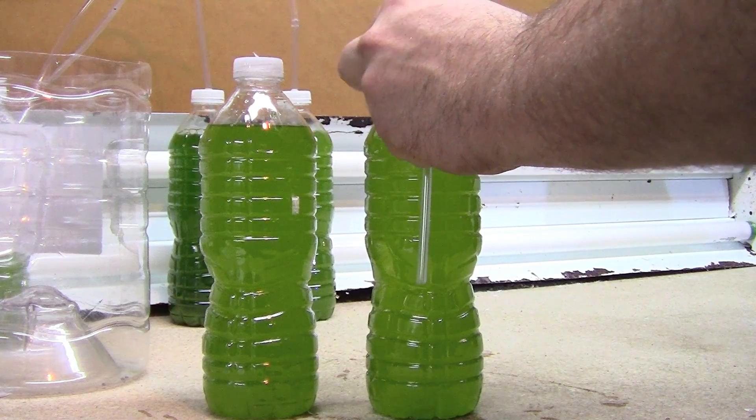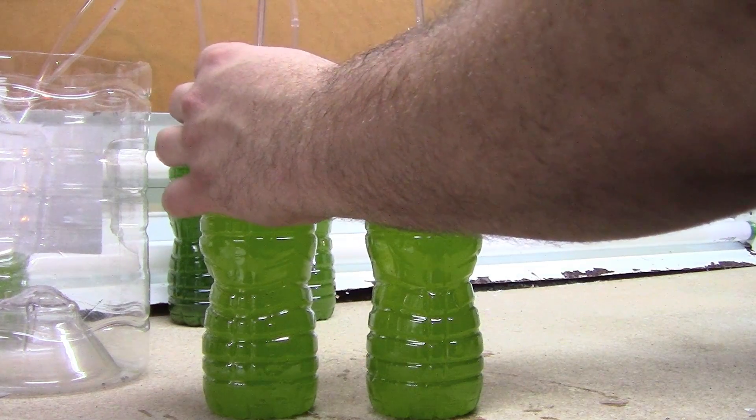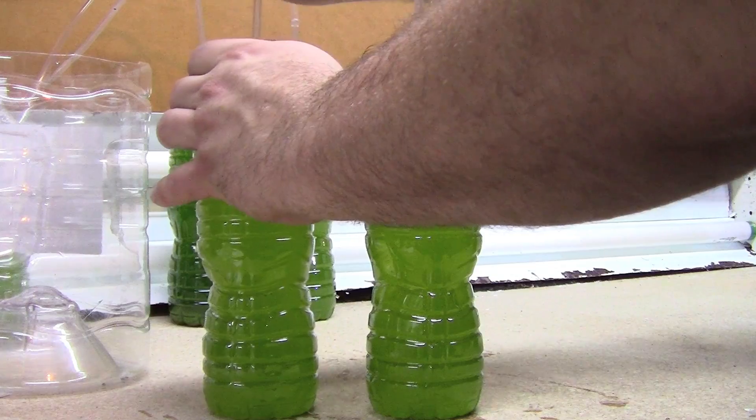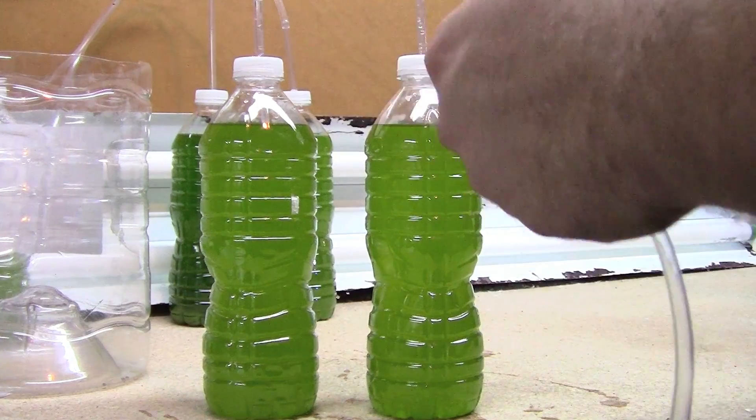I've played around with different measurements of F2 and I have found that 1 milliliter per 500 milliliters has given me the results that I've been looking for.